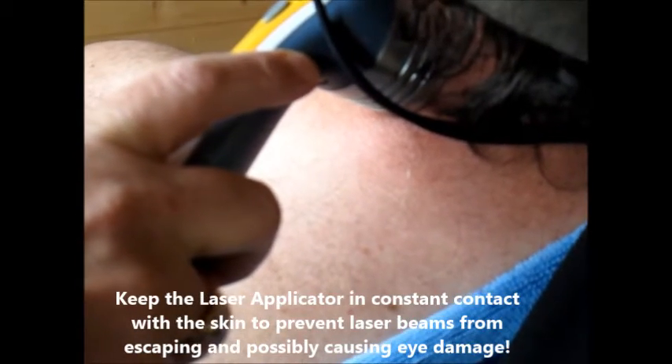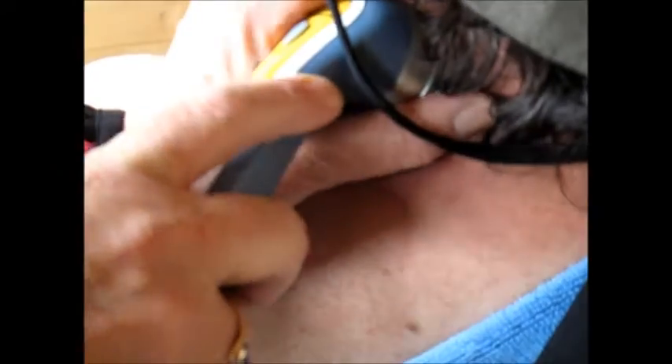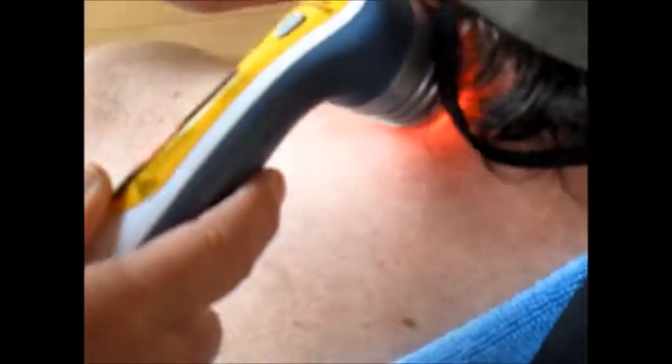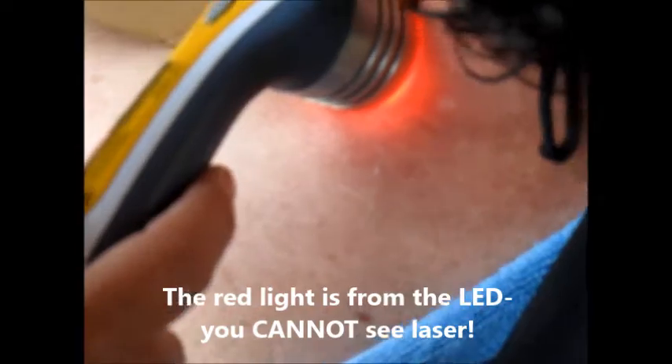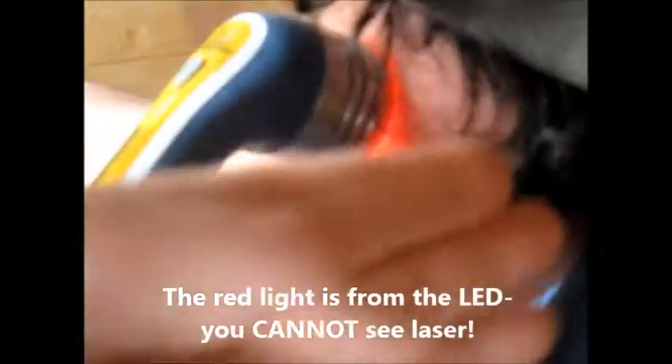It doesn't work yet — the laser will start in two seconds. Now it says laser is ready, press the button on the applicator to begin. You can see a little yellow light there — see the spillover? That's the LED. It has nothing to do actually with the laser itself, but it's a nice indicator to know that it's actually happening.